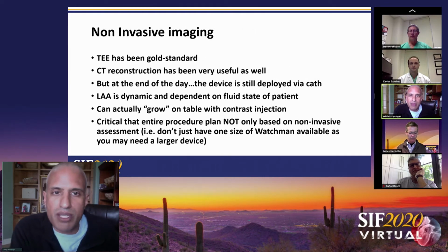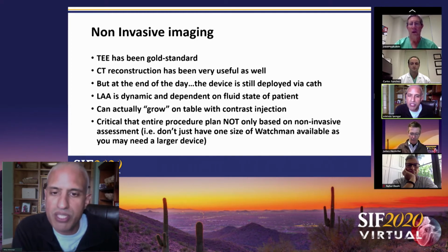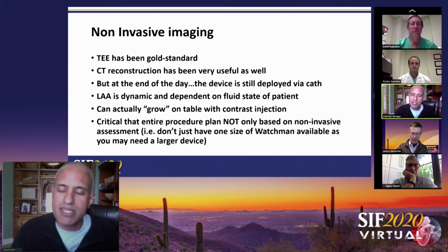Non-invasive imaging: TEE has been the gold standard, and CT reconstruction has been very useful as well. But at the end of the day, the device is still deployed via a catheterization. So we know that the LAA is dynamic and dependent on the fluid status of the patient. Being that I live at altitude now, I have personally seen firsthand appendages that were smaller on the TEE grow on the table with contrast injections. So it's critical that your entire procedure plan is not only based on non-invasive assessment, but that you have more than one size of device available in case you need to go larger.